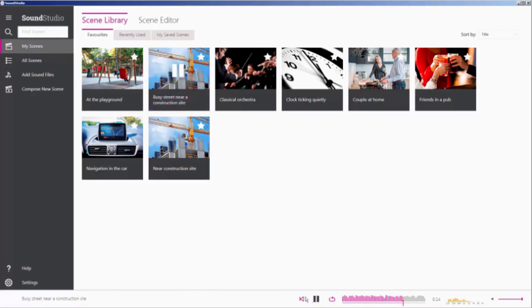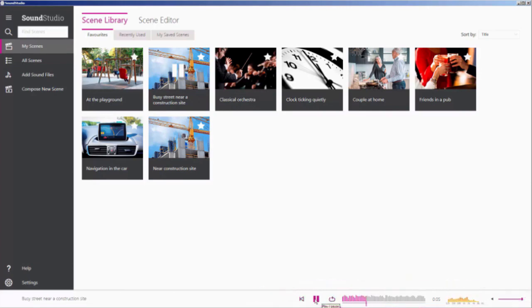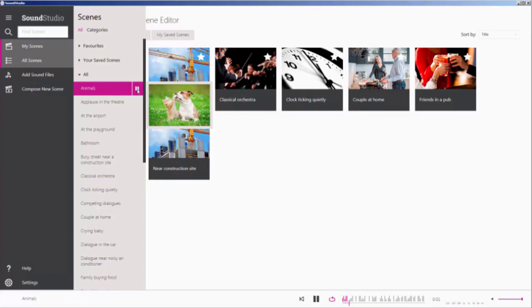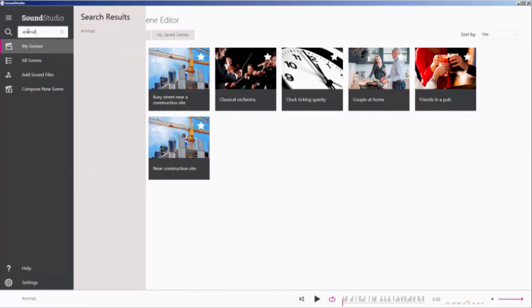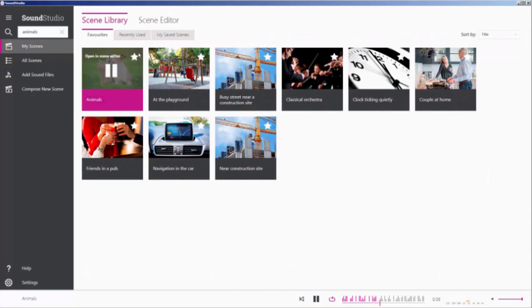Use the controls at the bottom of the screen to pause, rewind, and loop, and set the loudness if necessary. You can find more scenes in the All Scenes library. You can also use the search function to find a scene by typing keywords. If you mark a sound scene with a star, it gets added to the Favorites selection.